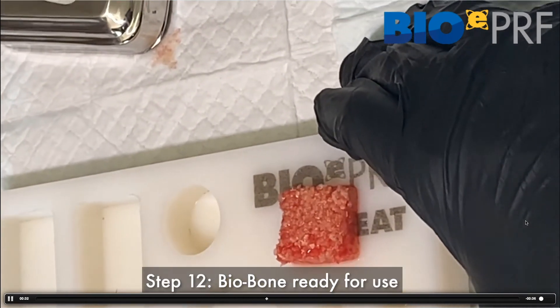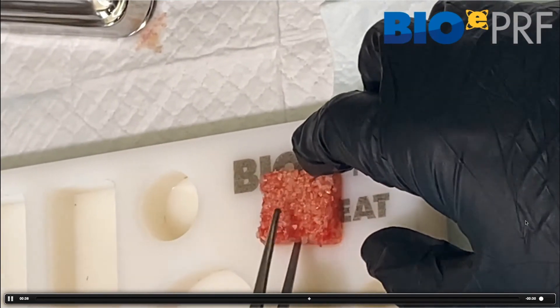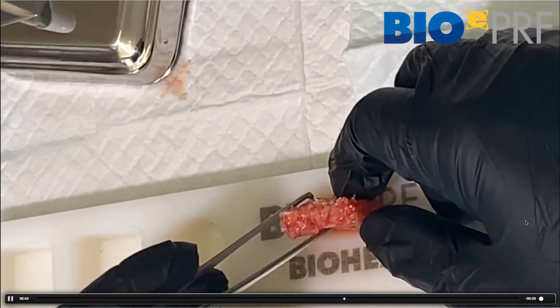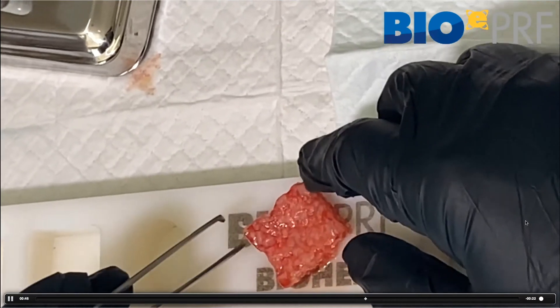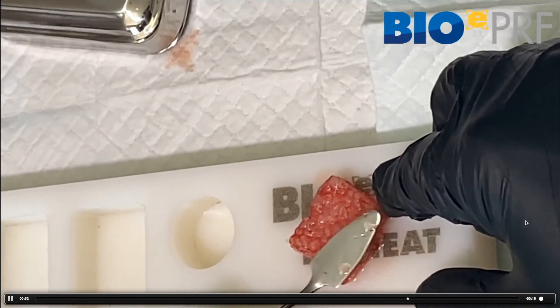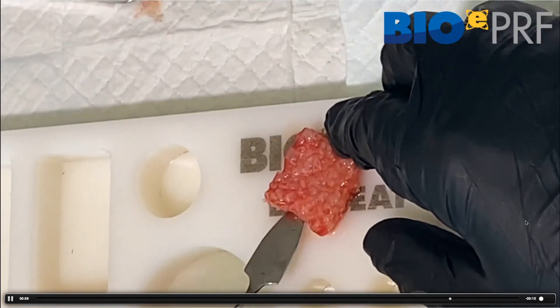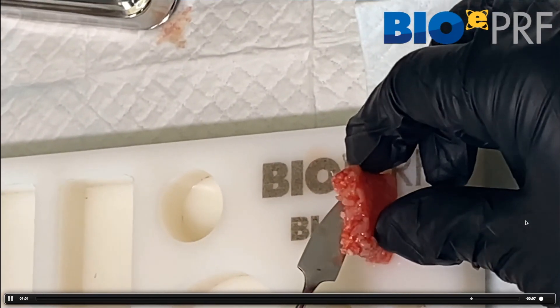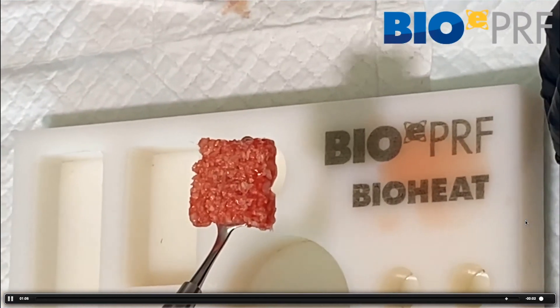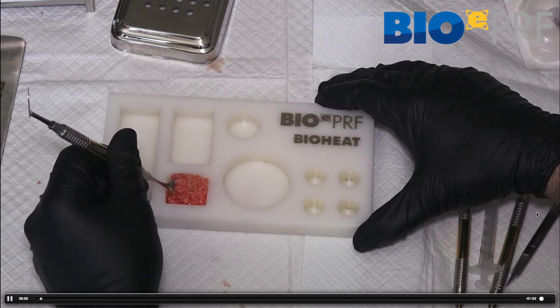What you see here is the sticky bone at the top. On the base side, you have the extended PRF membrane. All your albumin gel is there — those particles are not actually allograft, that's the actual albumin. This can be utilized for grafting procedures. The nice thing is it's got the sticky bone with the outer layer built in, and they're actually a lot tougher than they look. You can bring it to your ridge and lay it flat, making sure the sticky bone side is on the correct side.